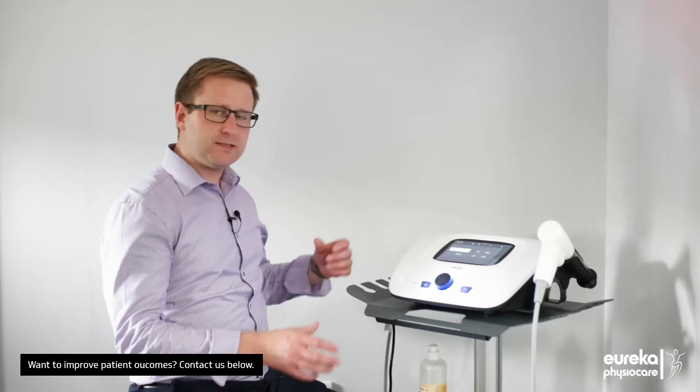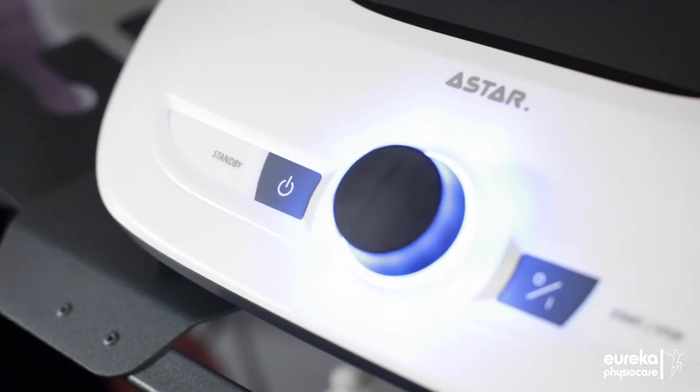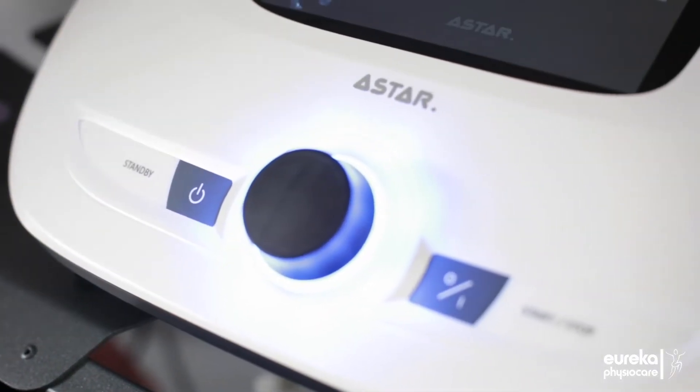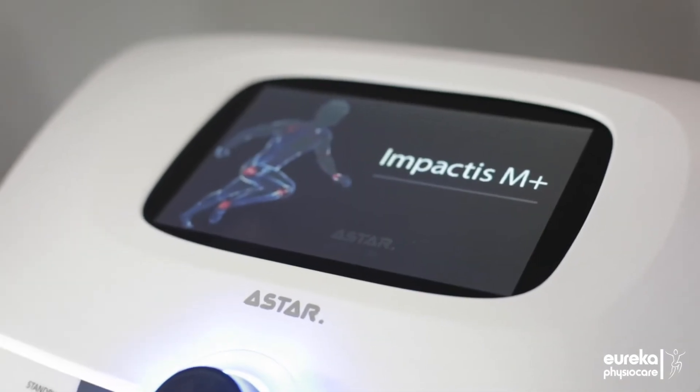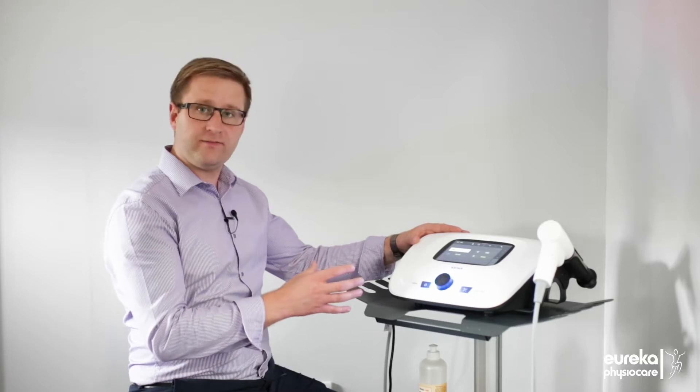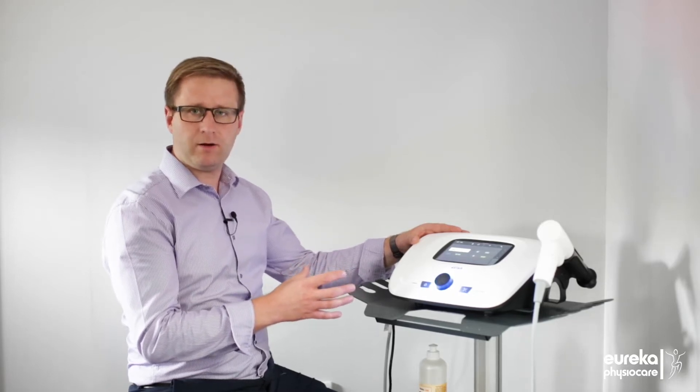This is the Impactis unit we have here, which is a very compact portable unit that means it can be easily transported between clinic rooms and even between clinics. It comes with five bar pressure, so it's a very high output power in a very compact unit.